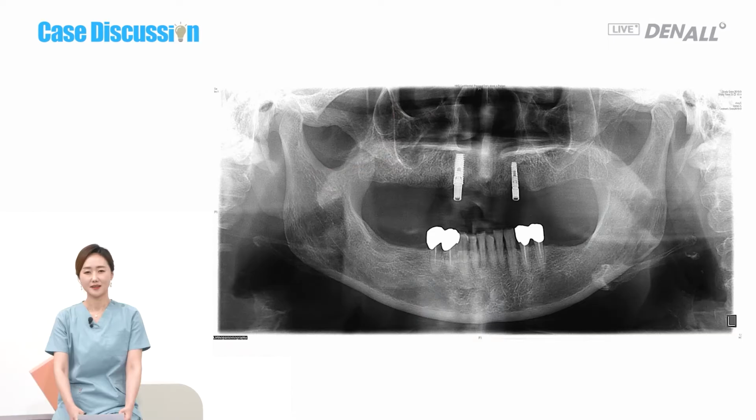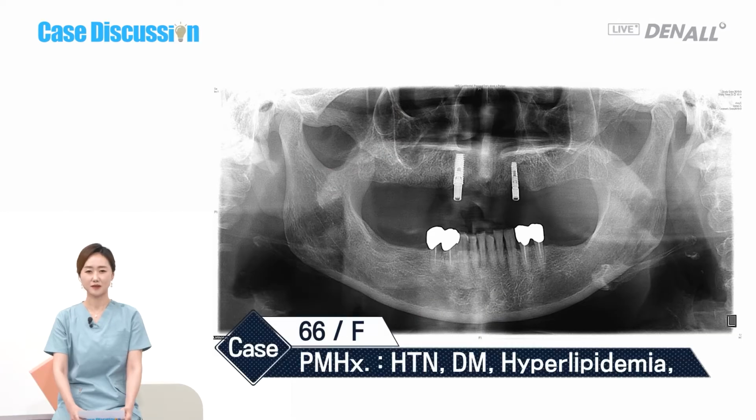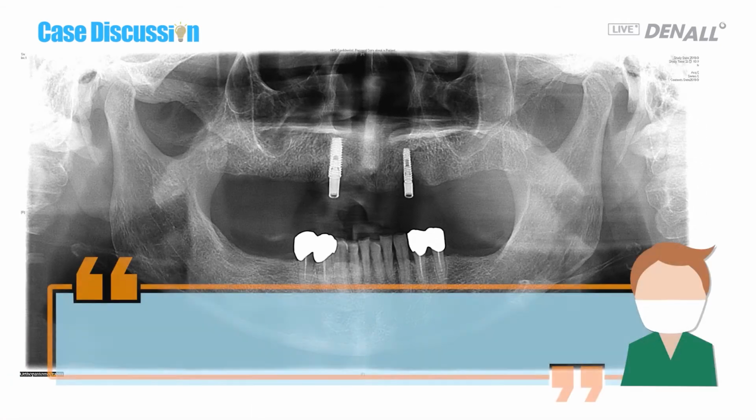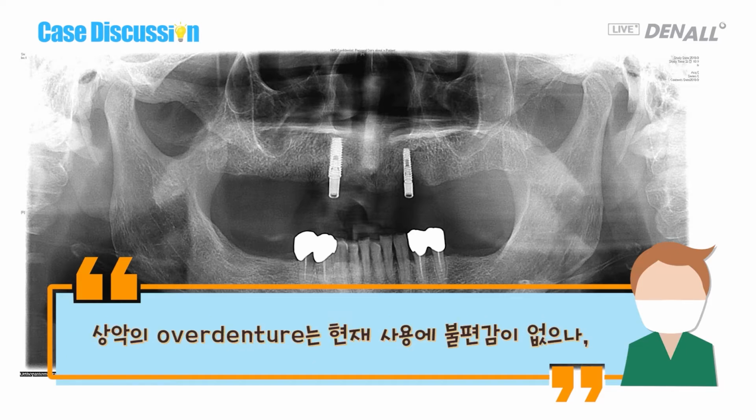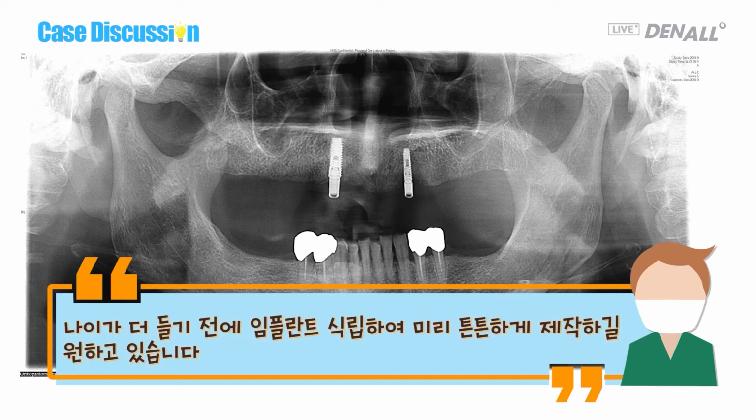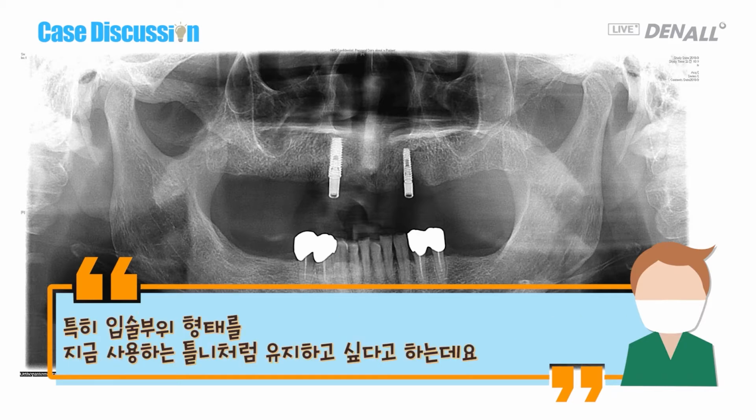Today's case is a 66-year-old female patient. She has hypertension, diabetes, hyperlipidemia, and chronic kidney disease. She has a maxillary implant overdenture and a mandibular RPD fabricated 2 or 3 years ago. The upper denture does not have a problem now, but she wants to place an implant to get a more solid prosthesis before she gets too old. She wants to keep the lip support of the denture she is currently using.